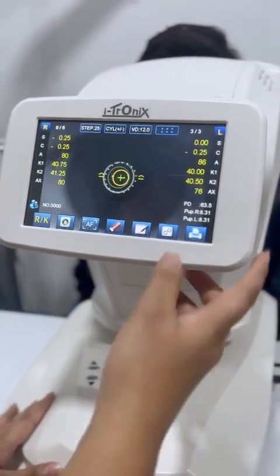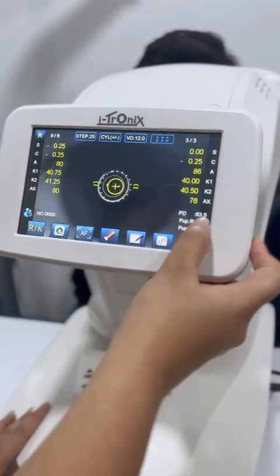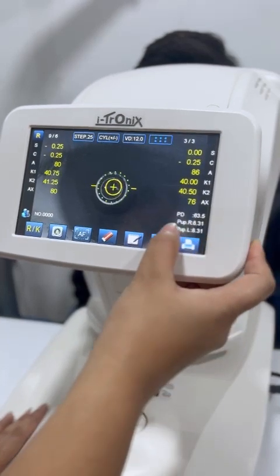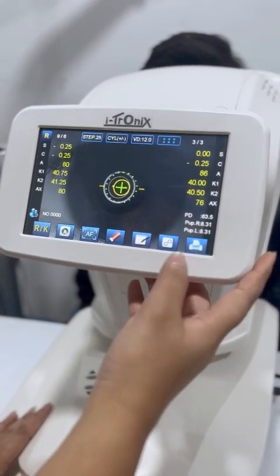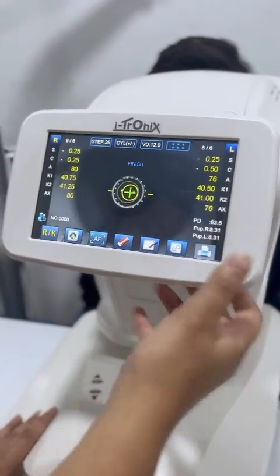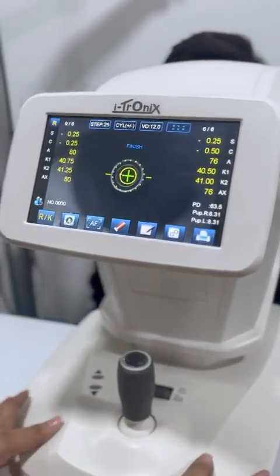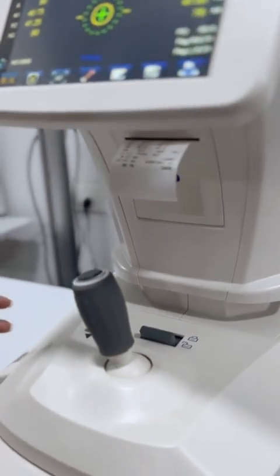And it is done. It will tell you the PD — right PD as well as left PD. And here you get the print option.